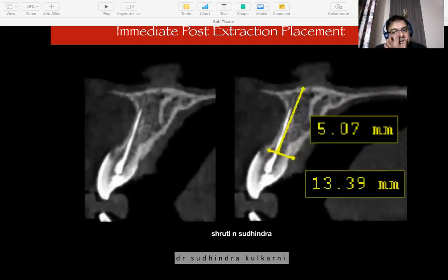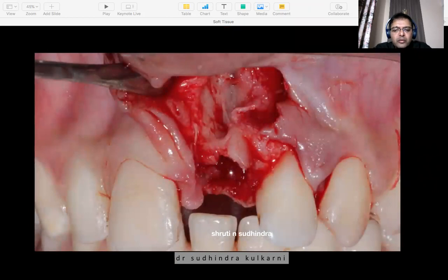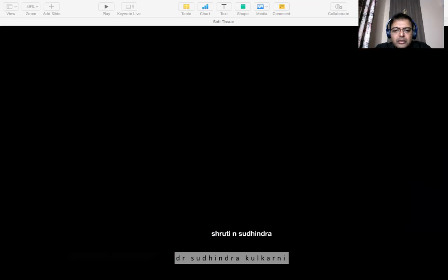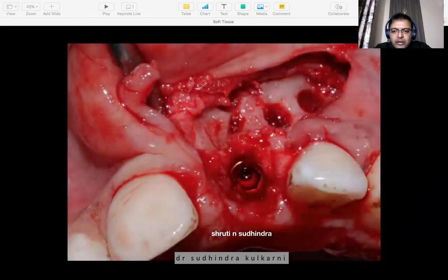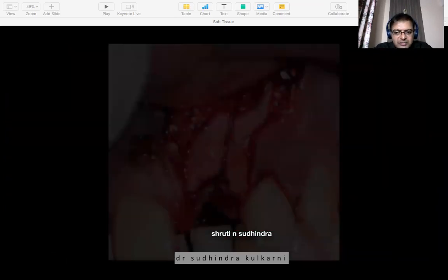What you see here on this CBCT is there's just a root and a gutta-percha present in the bone. We removed whatever remaining was there, traced down the GP, took it out, and then we had the implant going in. We harvested some bone from the adjacent site to do a bit of GBR and some slow resorbing graft, because it's more like a contour augmentation rather than a GBR around open implant threads.